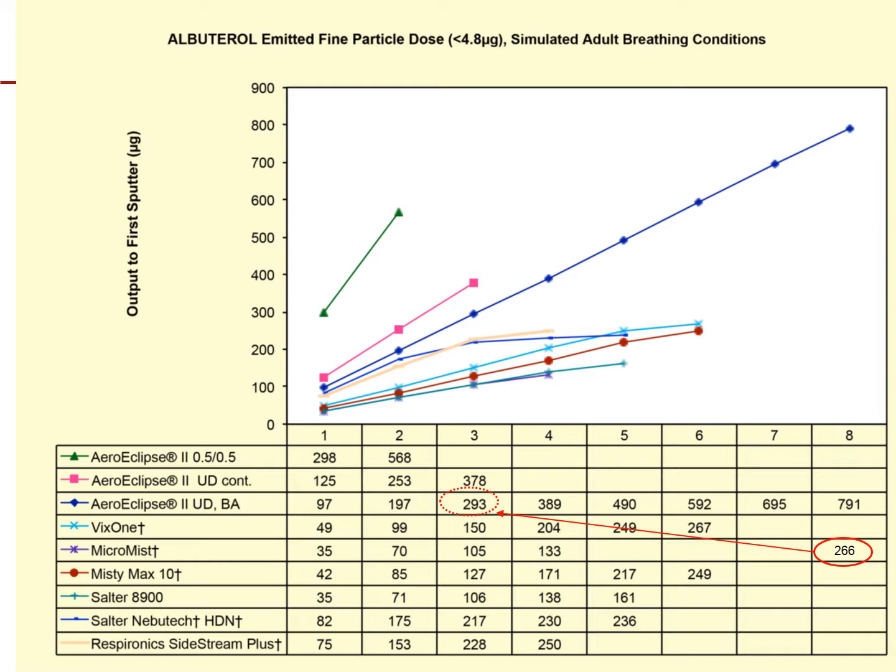This allows the respiratory care practitioner greater flexibility in care. For example, routine nebs can be given in 3 minutes. However, running the AeroEclipse for a full 8 minutes gives almost 3 times the dose that a patient would receive with the MicroMist. Therefore, a patient who is extremely short of breath may benefit from a full 8 minutes with the AeroEclipse as compared to 8 minutes with the MicroMist or even with the large volume continuous nebulizer.